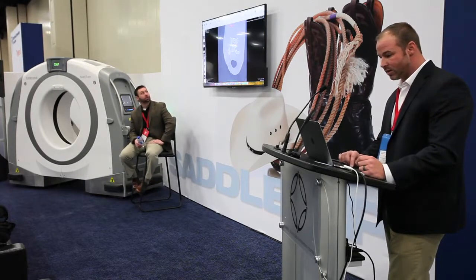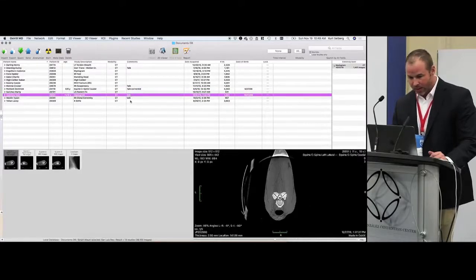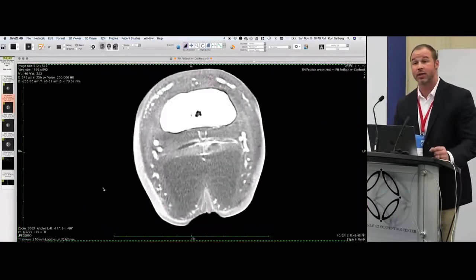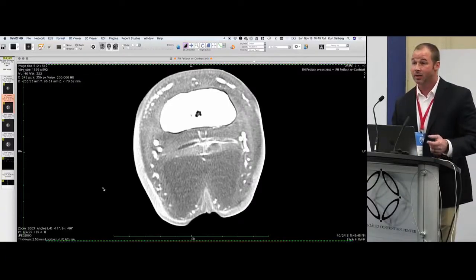But as I move on to another study in, let's say, the distal limb, and they had mentioned doing contrast, arterial contrast associated with the distal limb. That is important to think about because in the cone beam technology, we don't tend to be able to see that intra-arterial contrast very well. The scatter tends to eliminate it, and we don't see that as well as we'd hope.